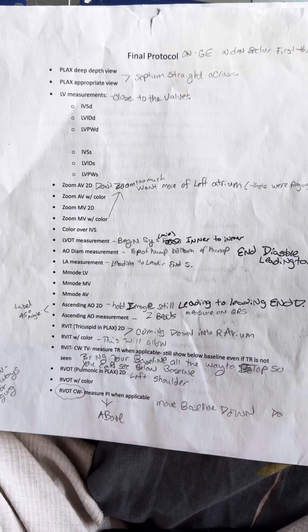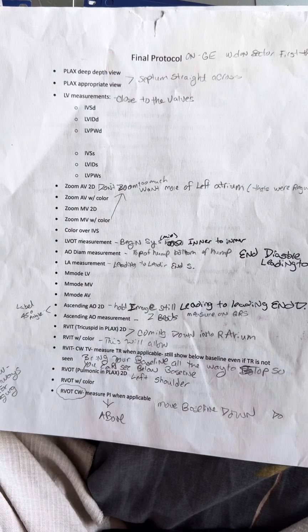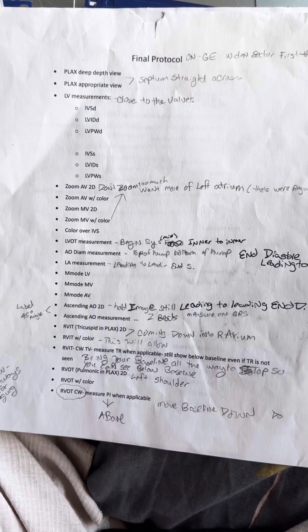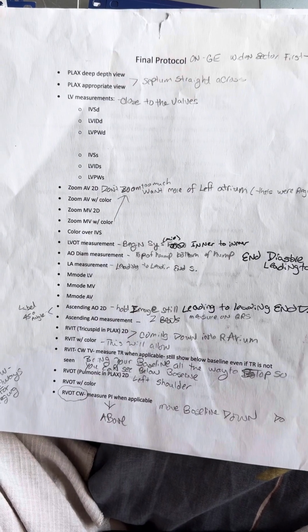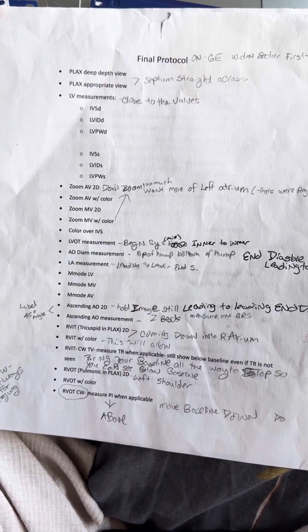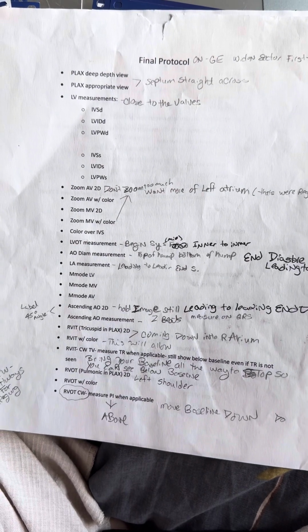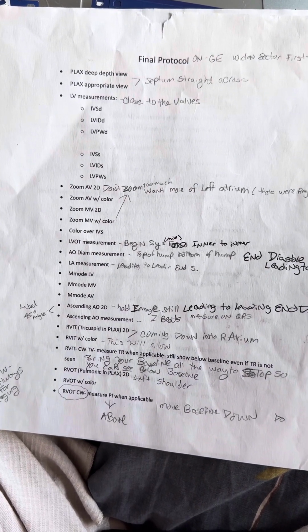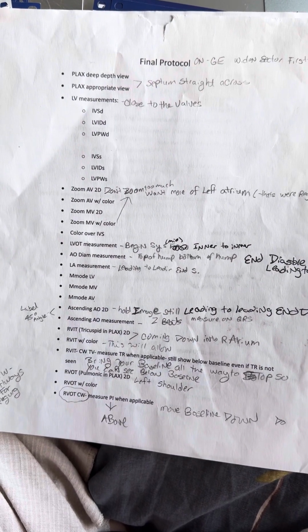Next, you want to zoom your aortic valve. Picture. Next, zoom AV with color. Also do your M mode of your AV.